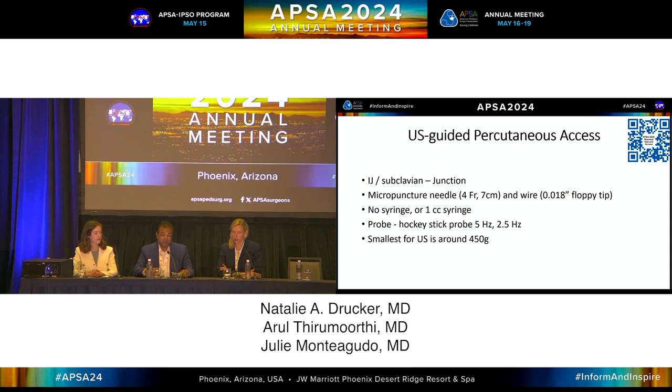And in small kids, we're talking half a centimeter. My personal smallest is about 450 grams, 1 pound. I've heard rumors that people can do it smaller, but that's about my cutoff. And the child I'm going to show you is just a touch over 500 grams.